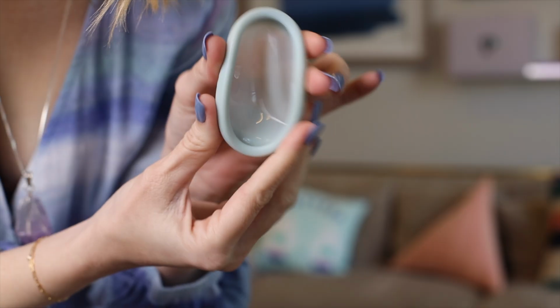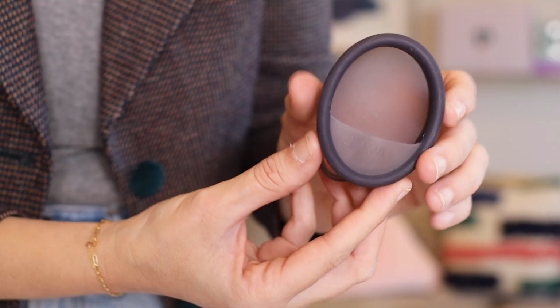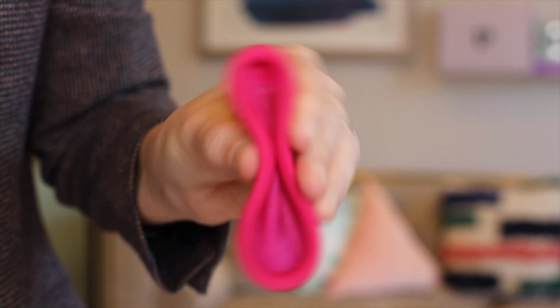Another tick in the pro column for menstrual discs is that they're just really easy to fold. They just fold in half. That's all you gotta do. There's no origami, there's no C fold, there's no punch down fold, there's no diamond fold, there's no 7 fold, there's no triangle fold, there's no labia fold. There's just fold. It doesn't even have a name, actually. You just fold it in half. This one I'm using here is the Flex Reusable. It has a notch, so it folds really narrow. Any disc is going to fold just in half, which makes it super, super easy.